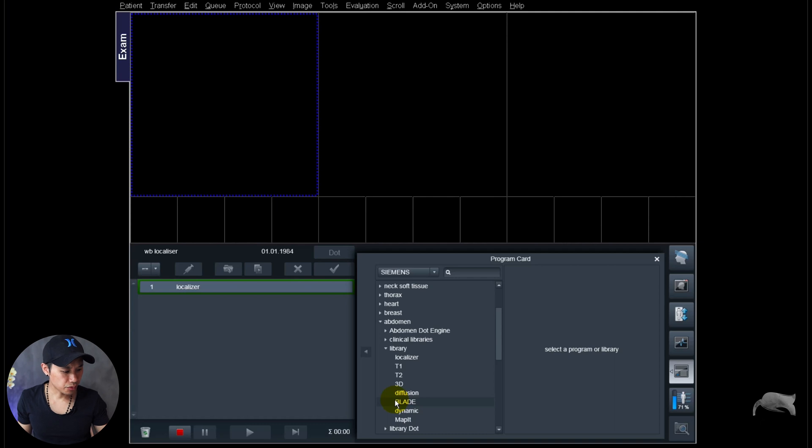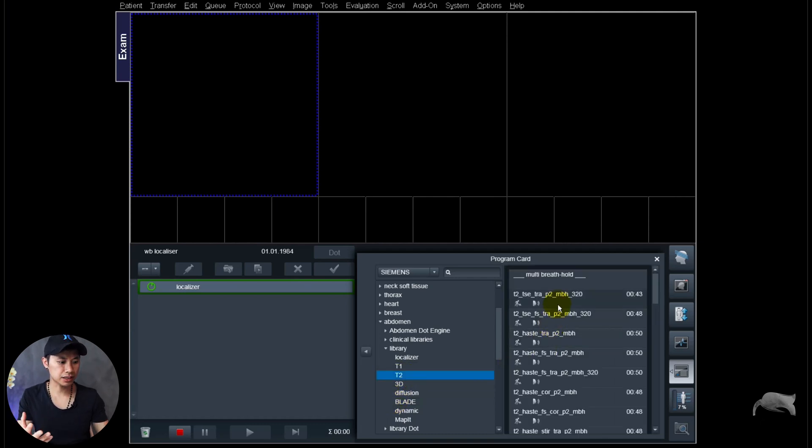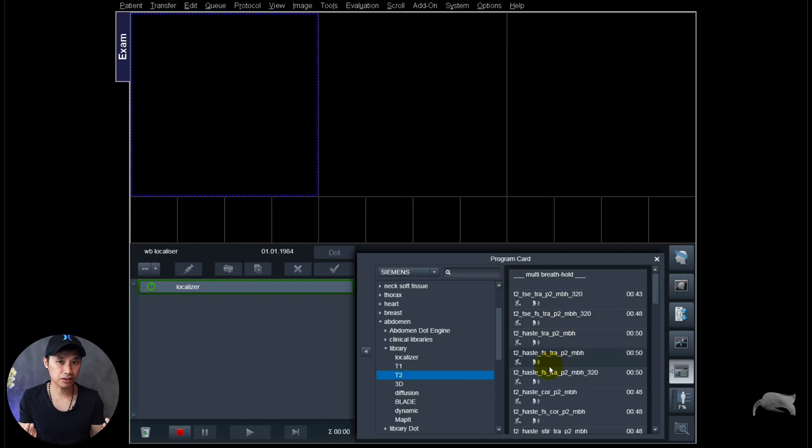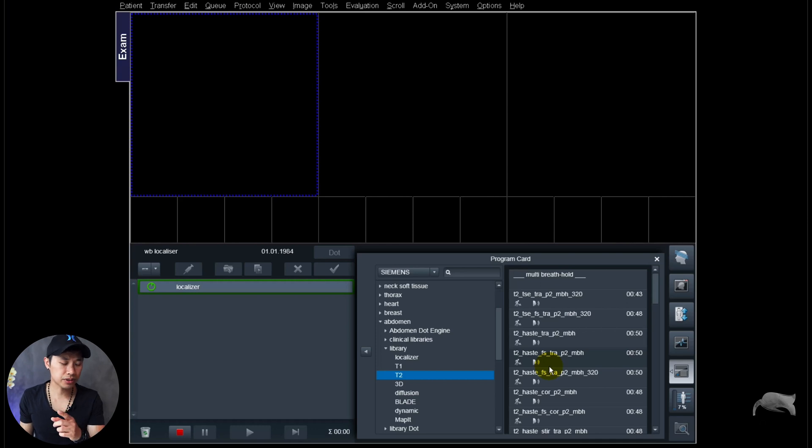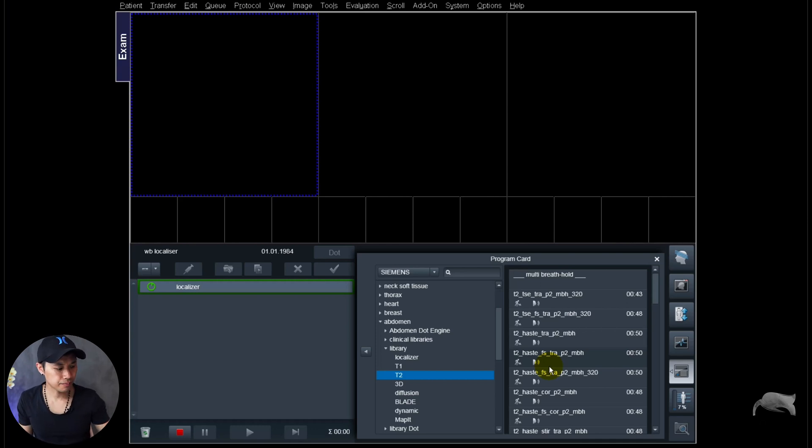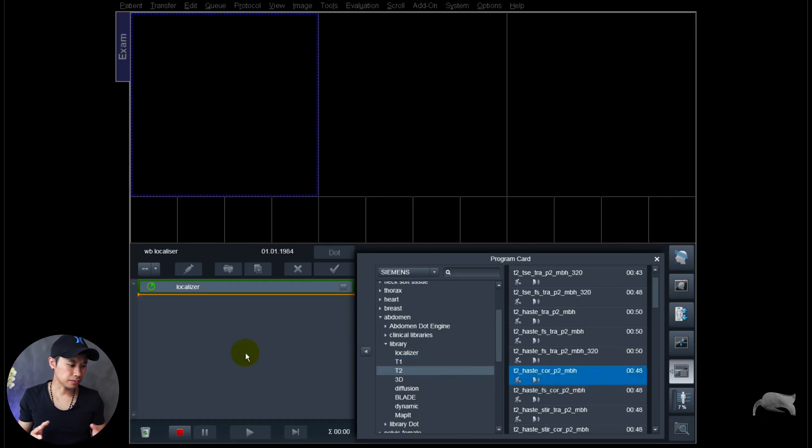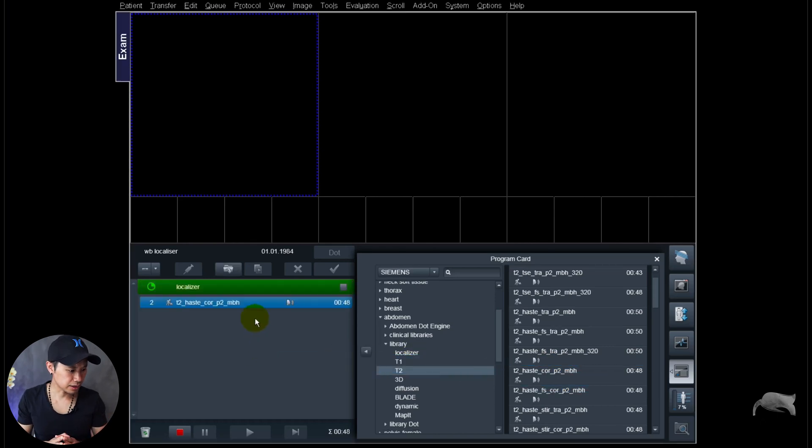And then I will go to abdominal protocol and go for a T2 HASTE because I want to use HASTE as a localizer. I find this fast and efficient and also gives me a good contrast so I can get a good overview. Also remember that a good localizer is always important.